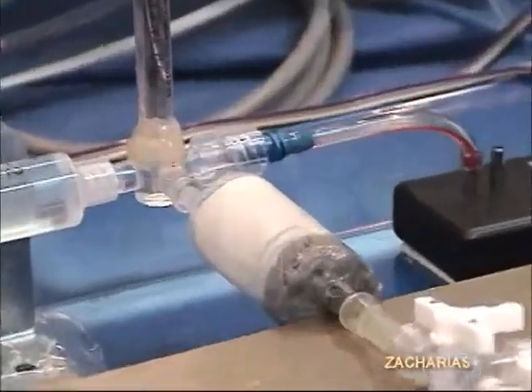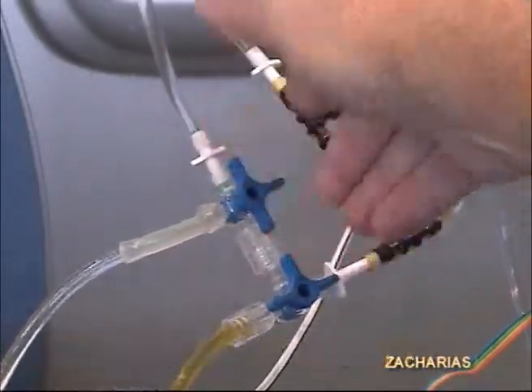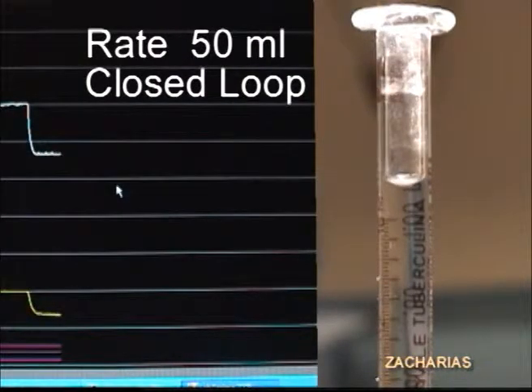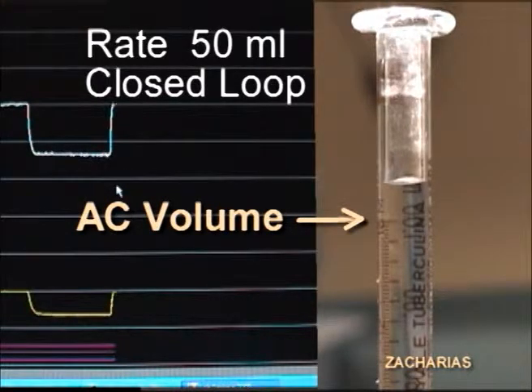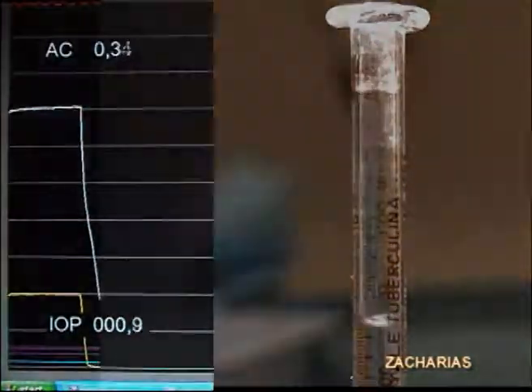We used an artificial eye chamber and animal eyes to determine surge, IOP, irrigation, and aspiration line pressures using MICS instrumentation. This modality of operation was named closed-loop IA, in opposition to the typical open-loop configuration. We could determine that the closed-loop system was able to maintain a stable anterior chamber using aspiration parameters that produced big fluctuations and even permanent negative balance in the standard open-loop modality.